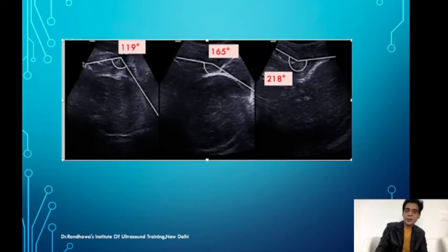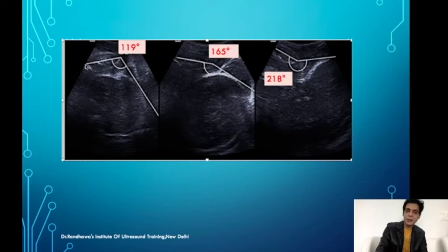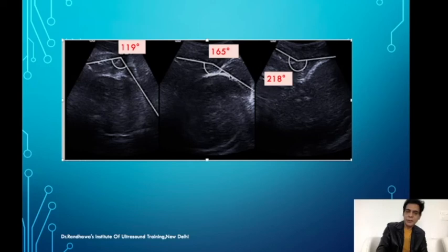Looking at these images: the pubic symphysis area is visible here — this is the superiormost part and this is where it ends. A line is drawn to the centre, and from where the pubic symphysis ends we draw another line touching the head. We measure the angle between the two. In another image, the angle through the centre of the pubic symphysis to the head is even greater, indicating delivery is very shortly going to happen.